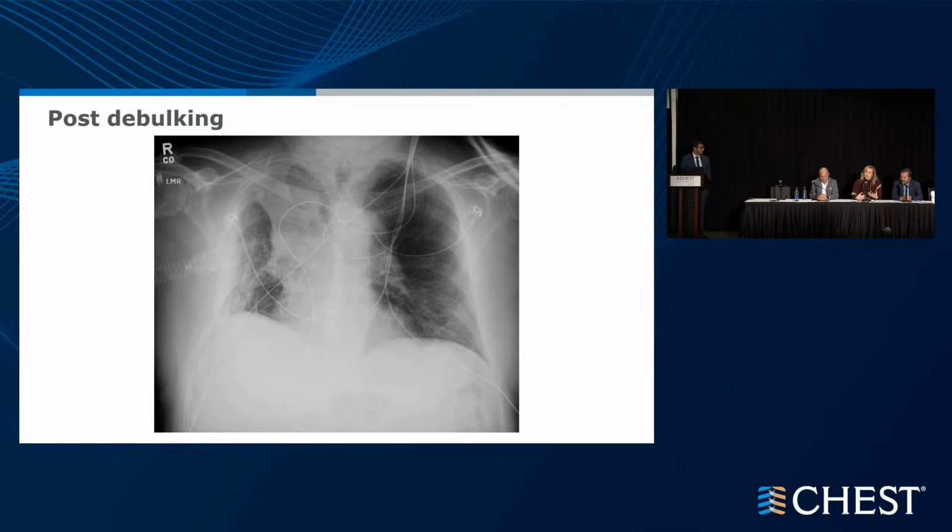And how do we know? I haven't heard what the pathology is. What's the response rate going to be with systemic and even radiation therapy in the interim? And you don't want him to run into the risk of having a recurrence of this emergent hypoxemia and that sort of thing. So I might even do some additional debulking. Sure. And really try to be flush with the right upper lobe takeoff.